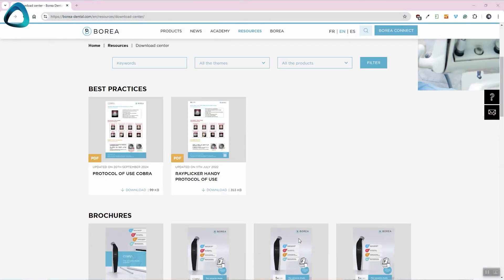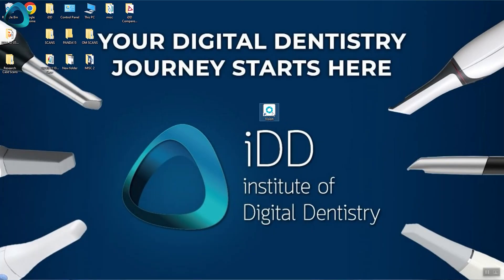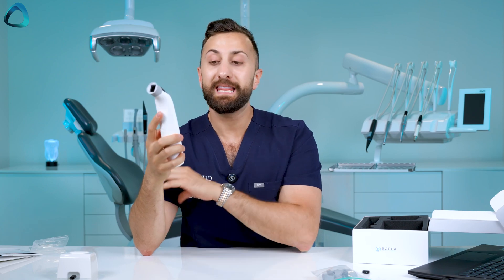For software setup, download the Vision software from Borea's website, install it, and don't forget to plug in the wi-fi dongle — this is critical for your computer to communicate with the Borea Cobra. Once that's done, pick up the Cobra and press and hold the single button. You'll hear a noise, the touch screen will light up, and you'll see a connection option — tap that to pair with the computer. That's the entire setup; the Cobra is now ready for taking shades.